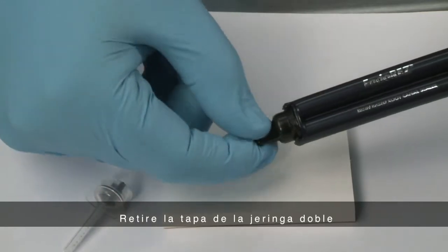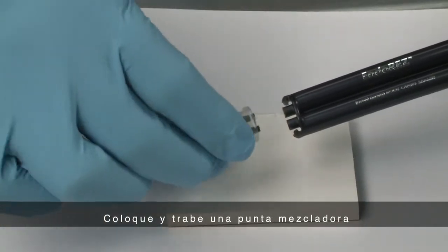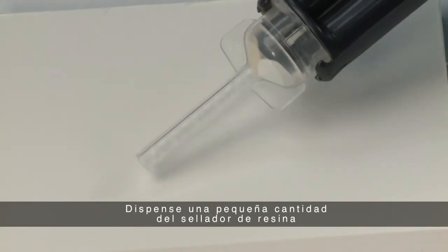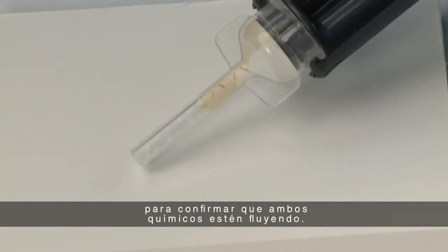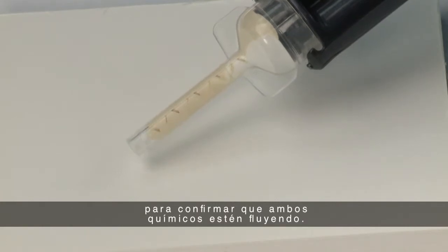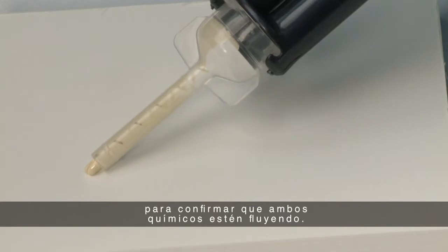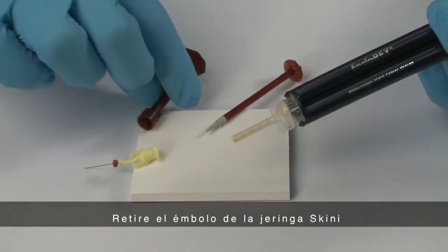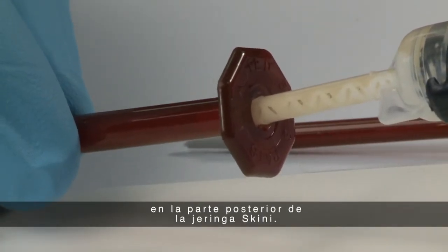Now, remove the cap from the EndoREZ dual barrel syringe and discard it. Attach and lock a clear mixing tip onto the dual barrel syringe. Express a small amount of the resin sealer to confirm that both chemicals are flowing. Remove the plunger from a skinny syringe and place the EndoREZ mixing tip at the back of the skinny syringe.